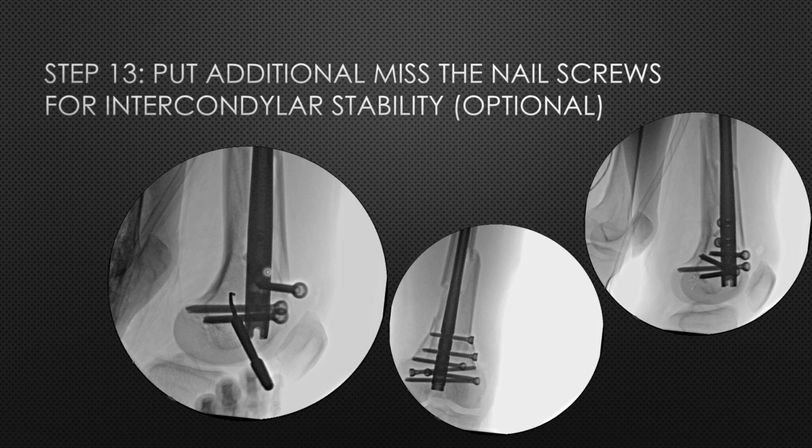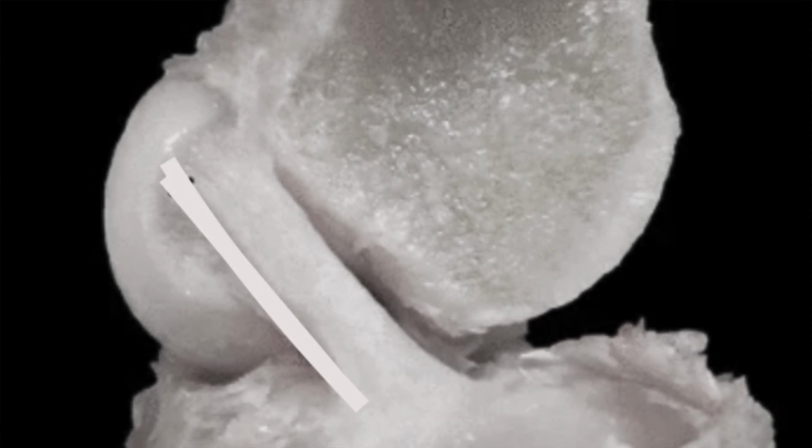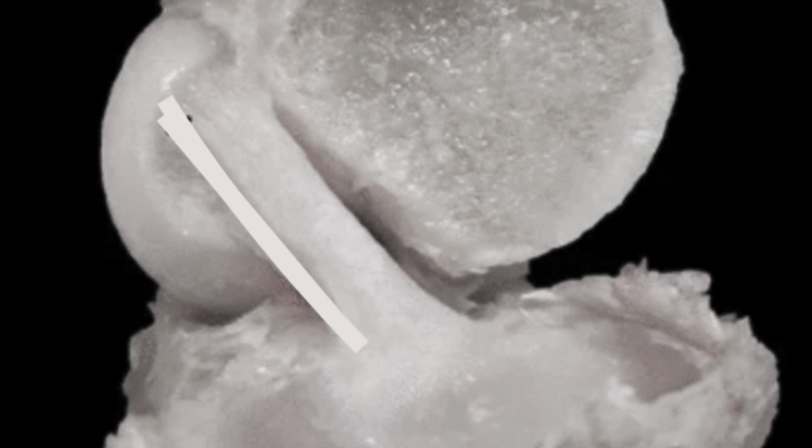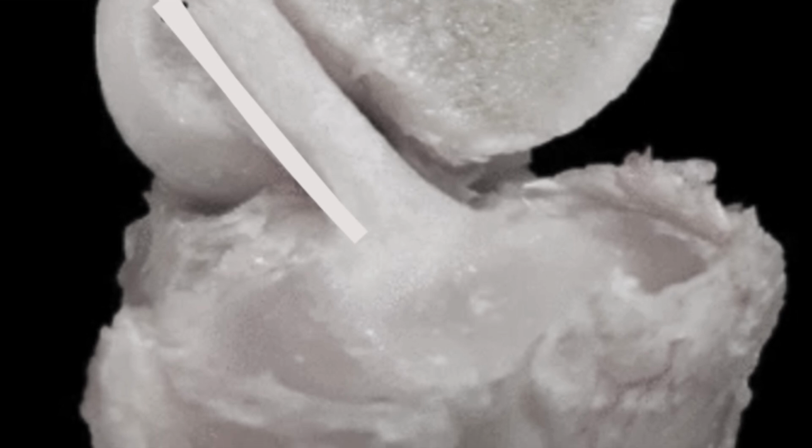Now I told you there are 4 locking screw options in the nail. But what you can do, you can have other windows available for placement of extra screws. You see, we have a zone here which is available for screw placement, and we have a zone here also that is available for screw placement. Whenever you are placing your screws, you can't place the screws in this posterior part, because that part is actually the part of the intercondylar notch. The Blumensaat line is the roof of the intercondylar notch, while the part which is posterior to it is the area where we have the cruciate ligaments. So we do not want to place screws in this zone to avoid injury to the ligaments.